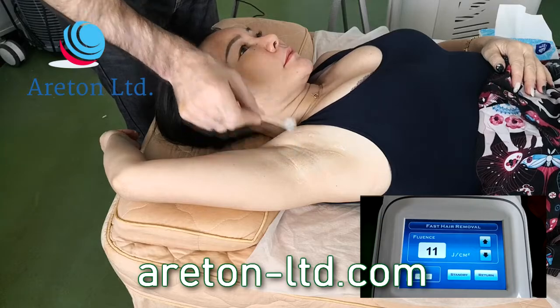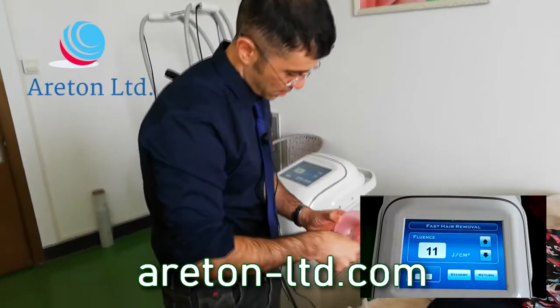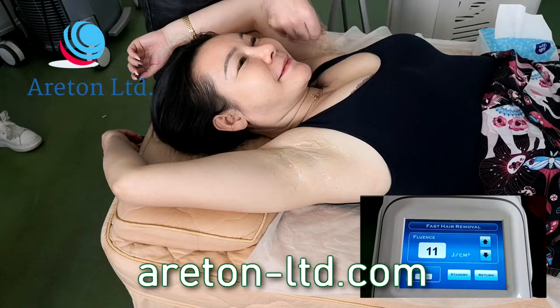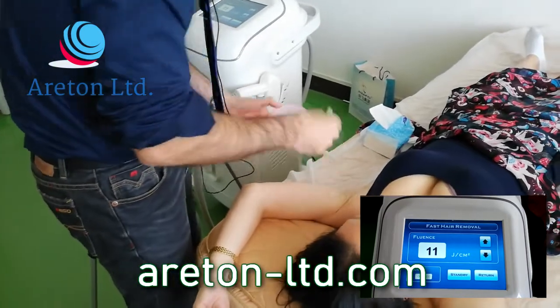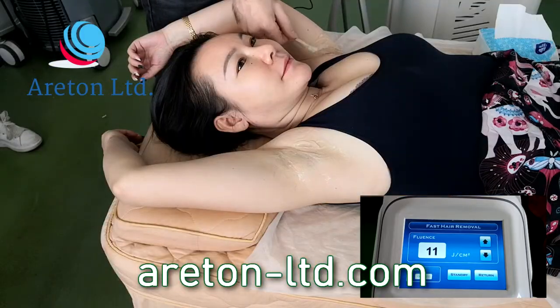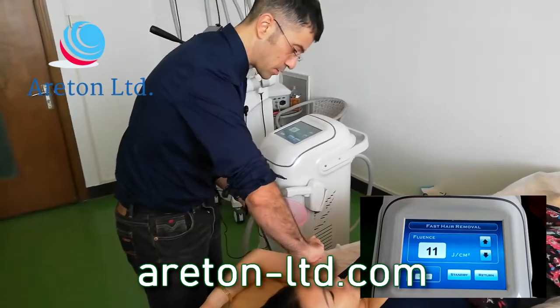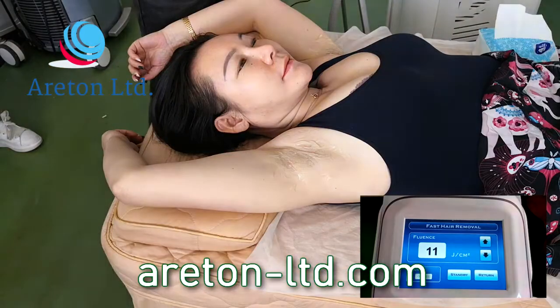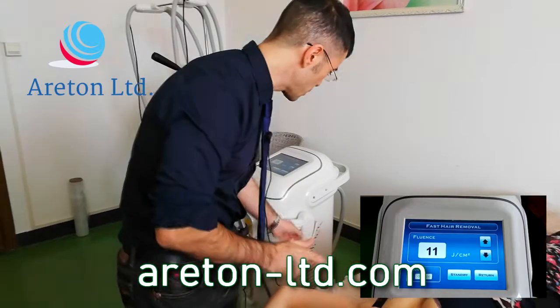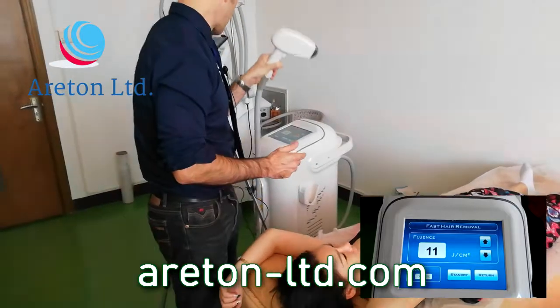So we've done this. So I should actually wear the safety glasses. Do not follow my example. So do what I say, as we say. Don't do what I do. So be safe. Just follow the safety procedures. You should use gloves and all that, but just for the sake of this video, so you see how easy it is to perform the treatment. And just now we're going to go ahead. So very important to get the device on before we start the treatment, so that the head is completely cold by the time we start.